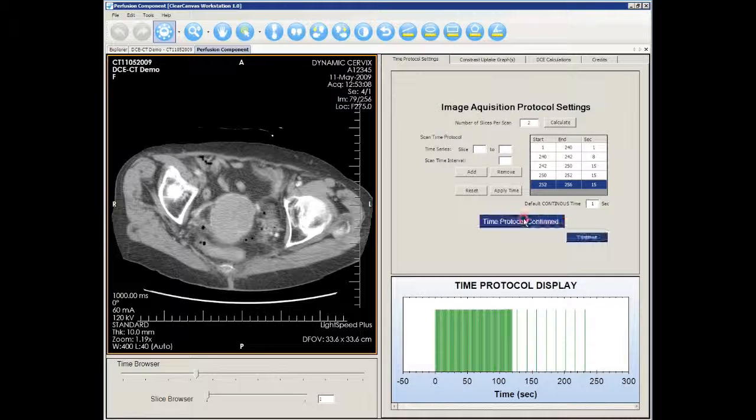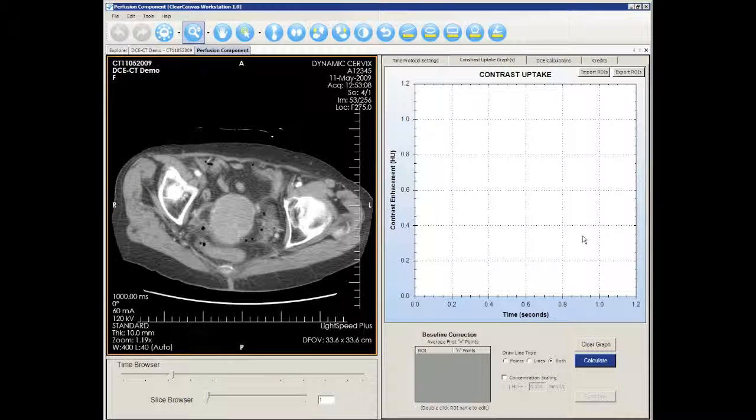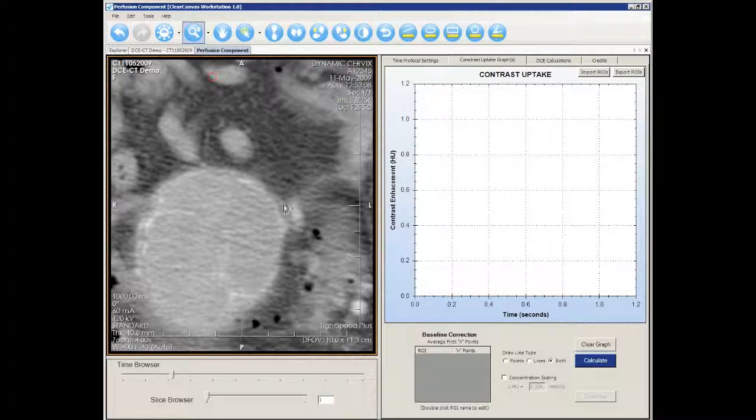Click Confirm Time Protocol and then click Continue to proceed. To generate contrast uptake curves, you need to contour your region of interest or import them from an existing file. Let's contour our own region of interest. Use the magnifying glass to enlarge the image.